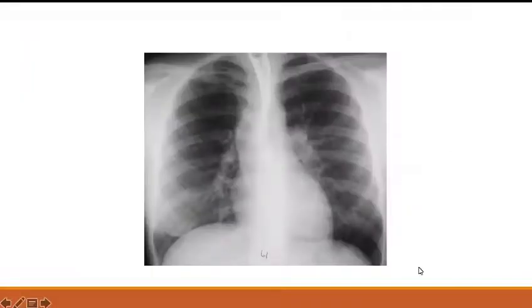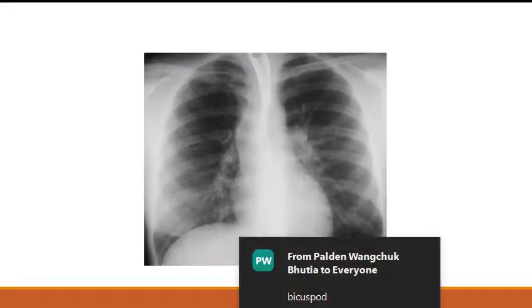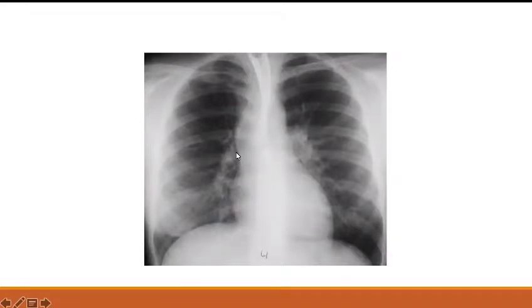This is a simple one — an adult with ejection click and systolic murmur. X-ray PA view with normal cardiothoracic ratio and normal pulmonary vasculature, chambers not dilated, but the ascending aorta is dilated. Given the history of ejection click and dilated ascending aorta, this is probably bicuspid aortic valve with aortic stenosis and post-stenotic dilatation.